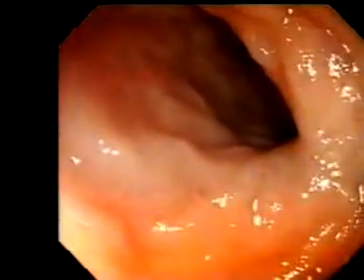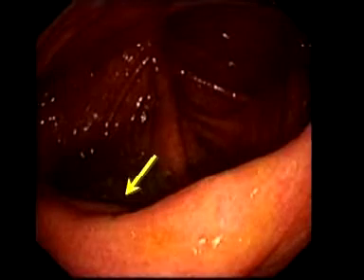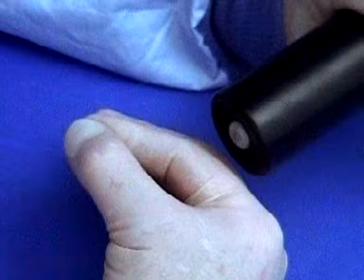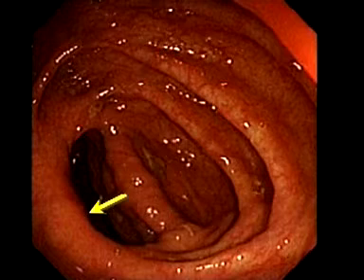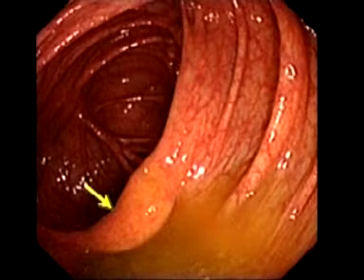The other approach to the ileum is the straight-on one. The opening of the valve is a slit, like a mouth, on the cecal side of the fold, with soft lips above and below. To locate the valve, withdraw the scope ten centimetres or so back from the cecal pole, and look for a bulge or deformity on the first large fold. Suctioning will often make the bulge more obvious — it may even bubble.